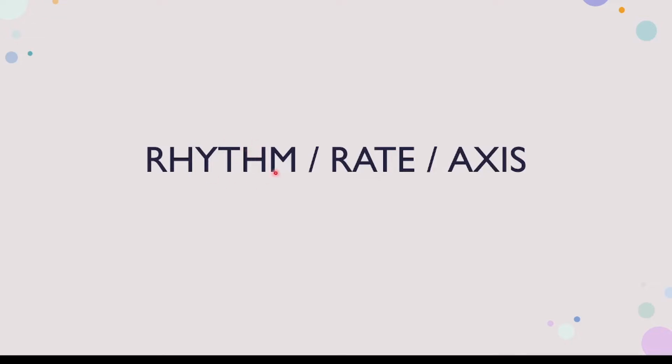So in today's video we will be focusing on the rhythm, the rate and the axis. In our previous video we had a look at the idea of sinus rhythms, so if you haven't watched that, please make sure you do. So without further ado, let's get started.